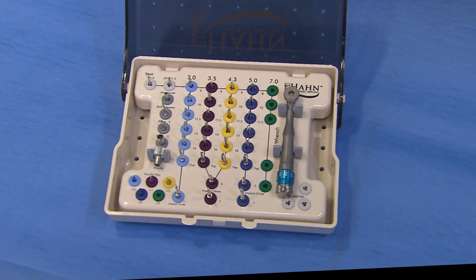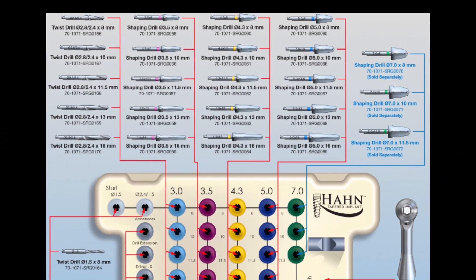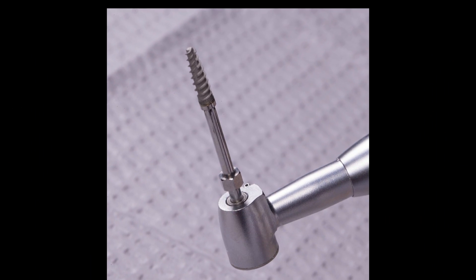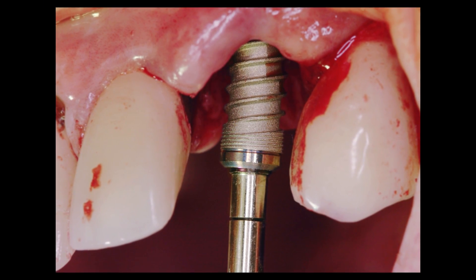With a streamlined surgical protocol, sizes for every region of the mouth, length-specific drills, and a thread design that allows for swift insertion, precise control during placement, and exceptional primary stability.